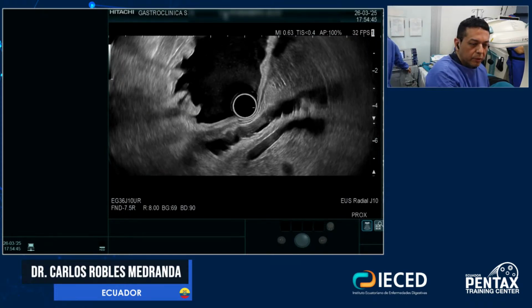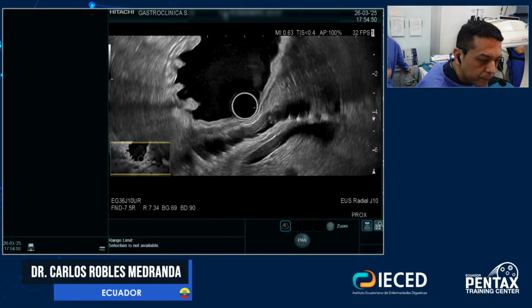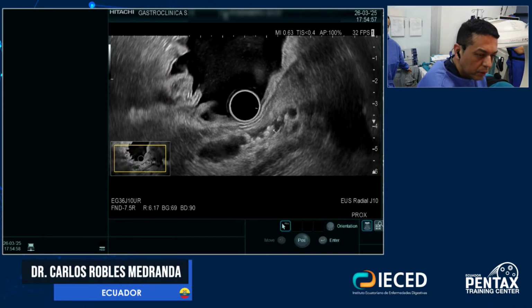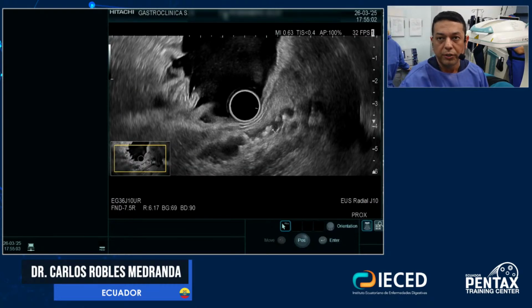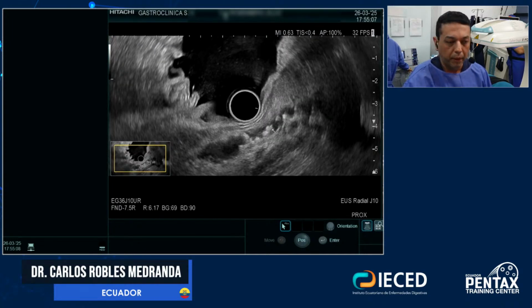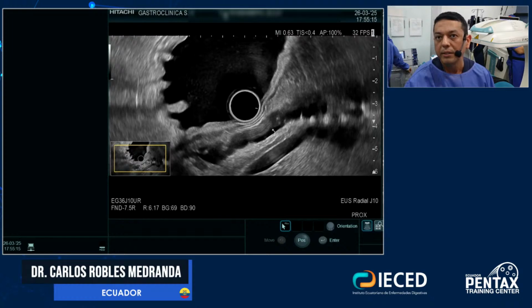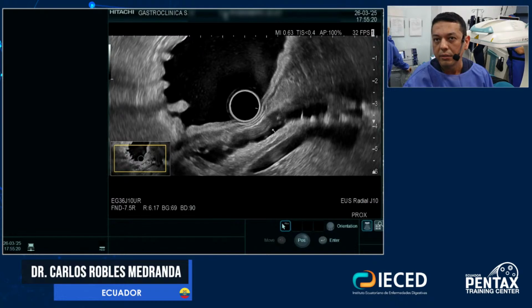You see again, these small areas, and I don't see the shadow, the hyperechogenic areas, these ones, you see. So my suspicion is that probably this patient doesn't have just a chronic pancreatitis. One of the possibilities is the presence of another kind of disease. You know, it means a kind of mixed disease. One of these is the presence of IPMN as disease, right?